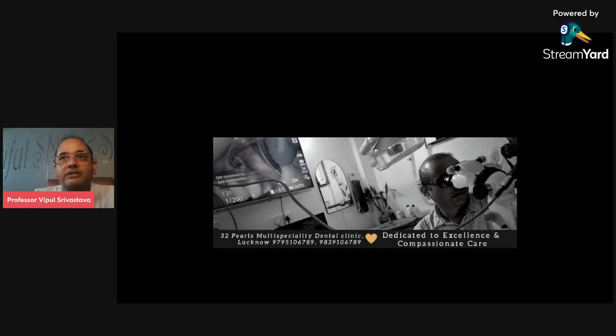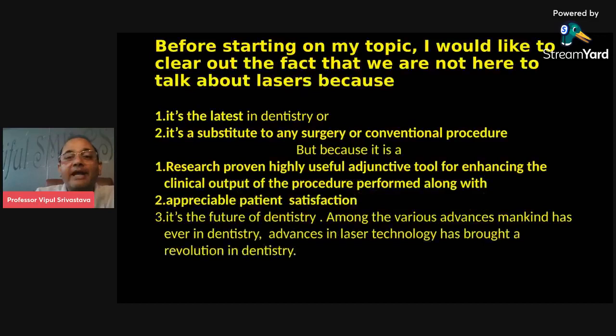Like if I use laser on a cancerous cell, it can promote the growth. Now, why did that question come? Because laser has the power of low-level laser therapy biostimulation, which is said to increase the potential, increase the growth of the cell.